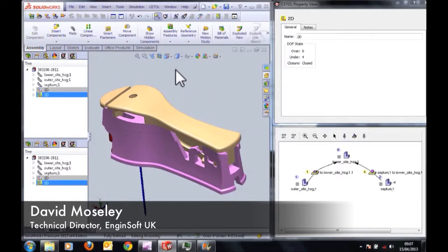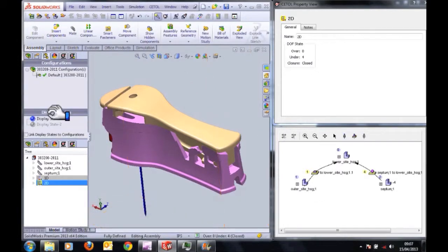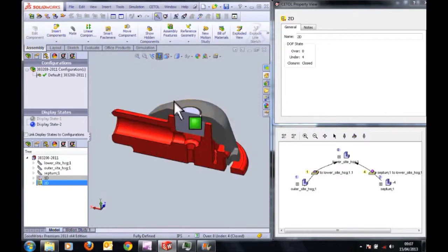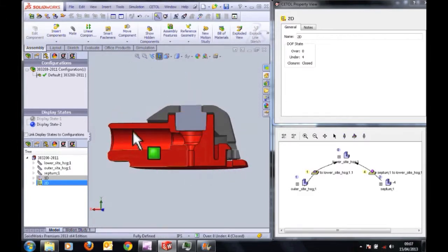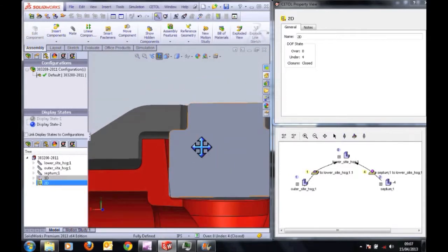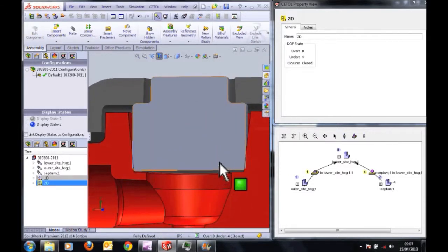I'm going to start by cutting away the things that I don't really need to deal with in this analysis. I'll take a section through that port so that we can see we're actually dealing with the port itself, and the red lower housing is this region here, and then the darker grey upper housing is around here, and this lighter grey region is the septum, and it seals against the lower surface of the upper housing, and that sealing condition is represented by the overlap between the two as it's modelled in the CAD, and we can see that the septum sits in this conical well in the lower housing.